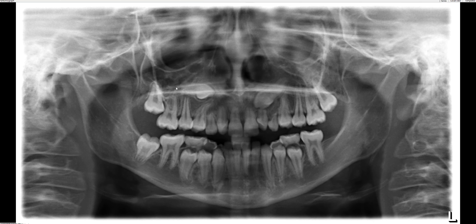Now let's take a look at number six — it's obviously horizontally impacted. There's a hard palate and a ghost image of the hard palate superimposed on top of number six. The primary canine again has shown normal resorption as we would expect. Number six shows distal dilaceration, so the space you have is extremely narrow because of the dilaceration of the adjacent teeth. Even if you are able to expose that tooth, how could we successfully extrude it into this area without causing resorption of that premolar or the lateral incisor? It's a tough case for the orthodontist.